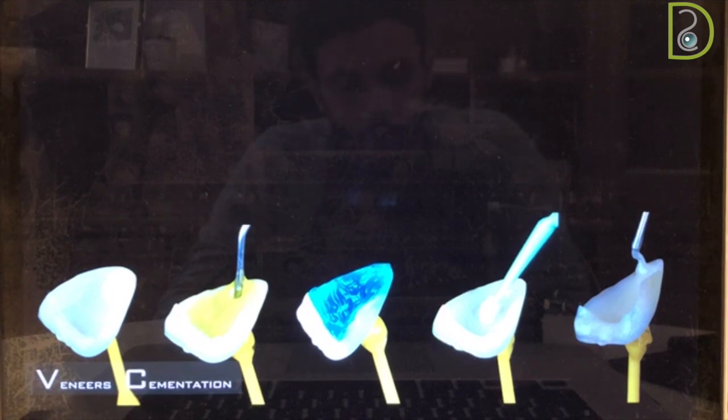So the only thing I would recommend is have a proper isolation, and start with the two central incisors together, then follow the rest. You want to go ahead and do the canines, after that go back to the laterals, it's fine. Or you want to follow up and start laterals, then canines, then premolars. There is no right and wrong in this, as long as you follow the proper procedure and sequence.